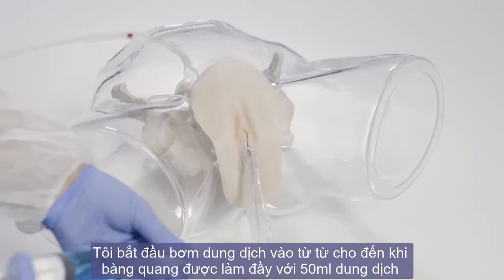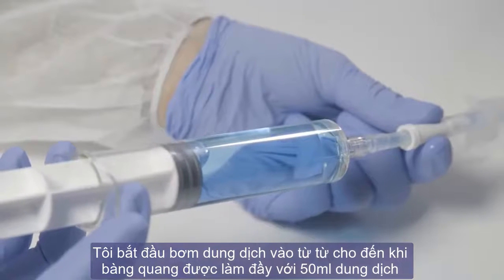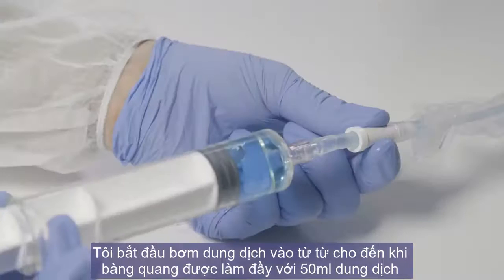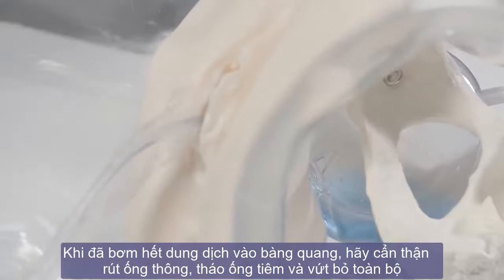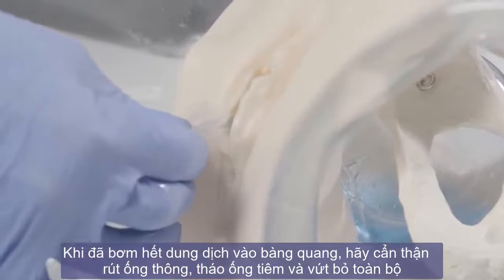I start instilling the solution gently until the bladder is filled with a 50 milliliter syringe solution. I extract the catheter.